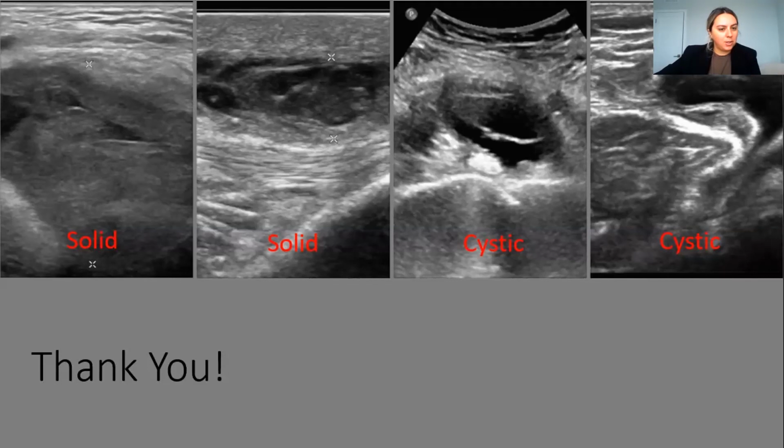All right, I just got 2 more questions submitted. How can we differentiate between bicipar... Okay, I'm sorry, I may not be able to pronounce all of this, so I'll just copy paste for you. Can you see the questions, Dr. Salibian, in the Q&A box?